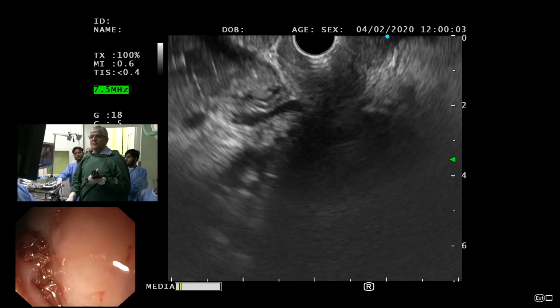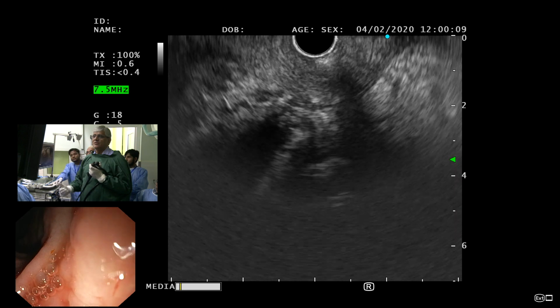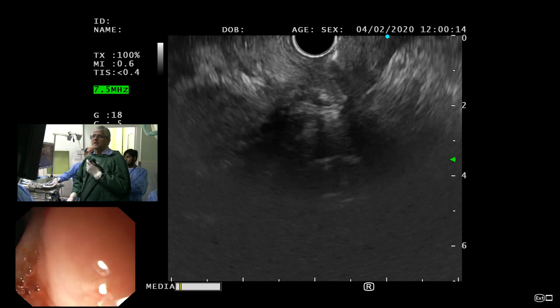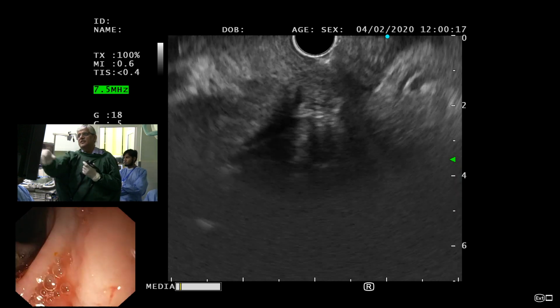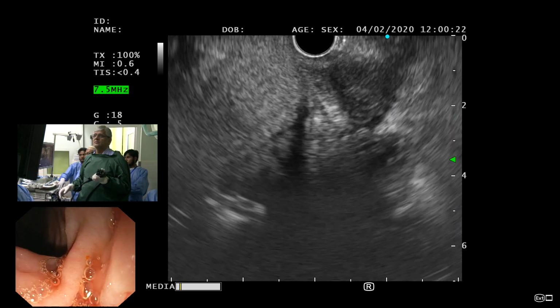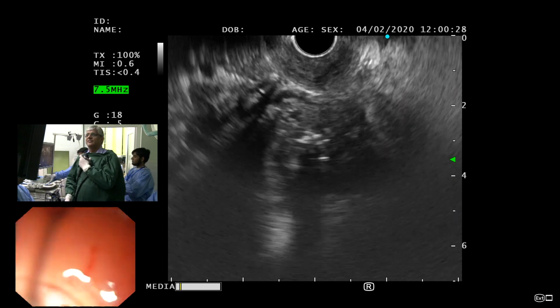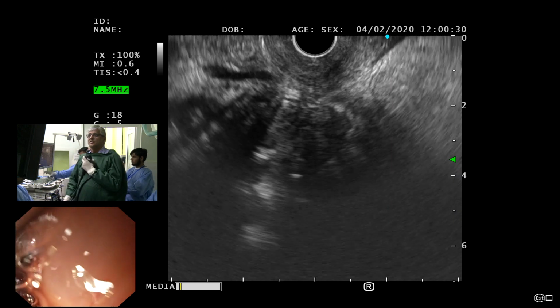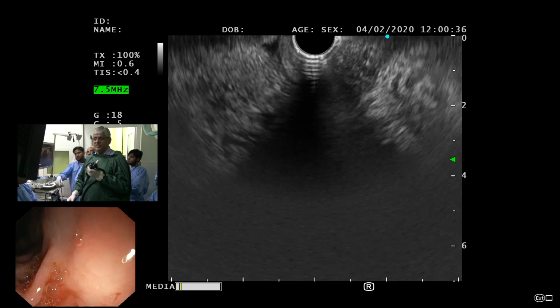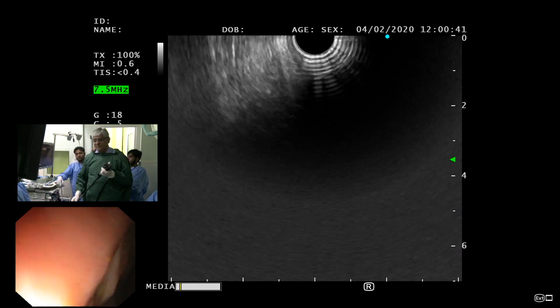So we are actually, you remember yesterday you were telling me. I've actually done this examination from just the pylorus. I could not peep into it properly, and I don't want to advance too much, because if you look at this, Khalid, the duodenal wall itself and that area, it's all infiltrated. It's thickened, infiltrated, and definitely it is. And also, when you're trying to go into the pylorus, there is some bleeding, and there's thickness, so I don't think there is a need to go there.